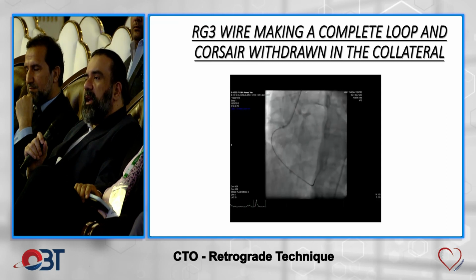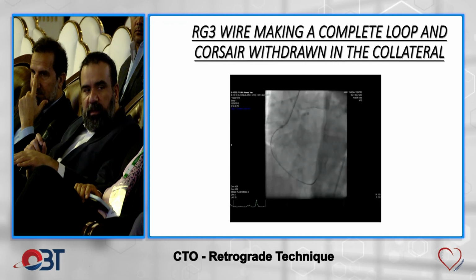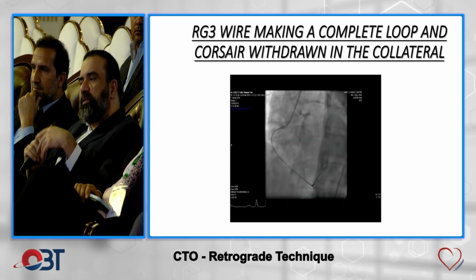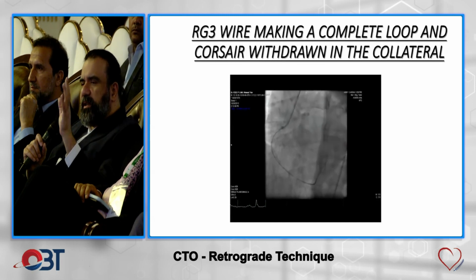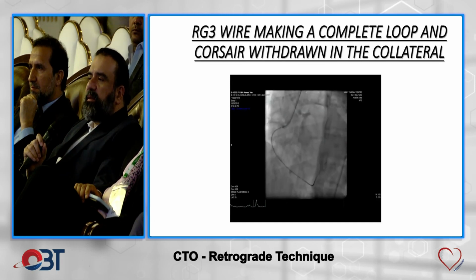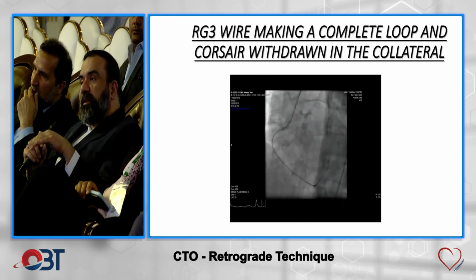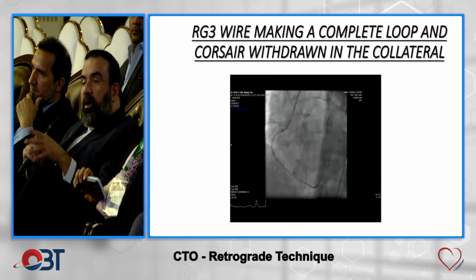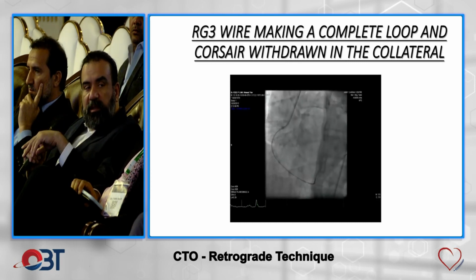But again, I have done a lot of antegrade and failed before I get to retrograde. So my focus usually, I would say that in a year I do about 120 cases of CTO, let's just say for example. I would say the vast majority are done antegrade. The only time that I do retrograde is if I've tried antegrade and it hasn't worked, or if there's a vein graft that's failing and I can use that before it shuts down completely.